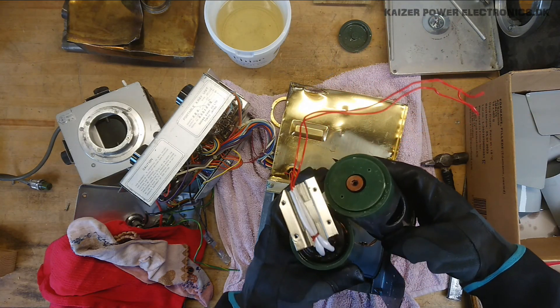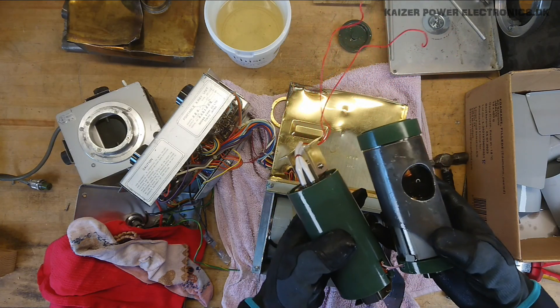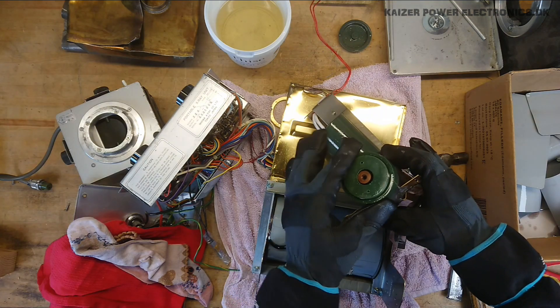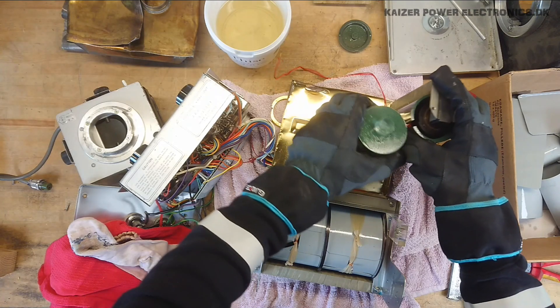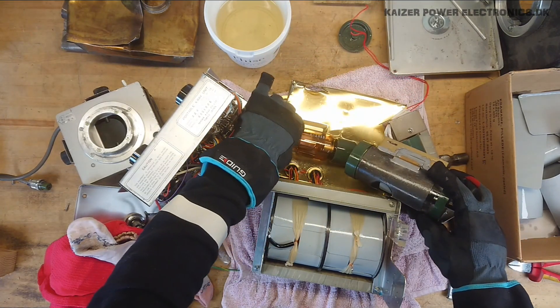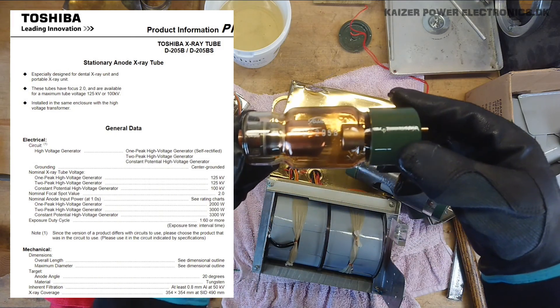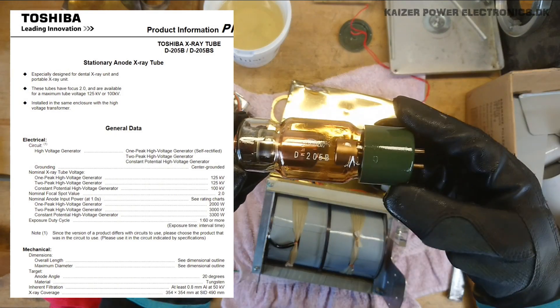Have two primary leads here — 230 volt AC. And then we have the x-ray tube itself, which is again mounted inside another enclosure. That's actually screwed in place there. Seems like it's just sitting — the filament connections there. There we have it. Seems like a custom base. It's a Toshiba D205B x-ray tube.